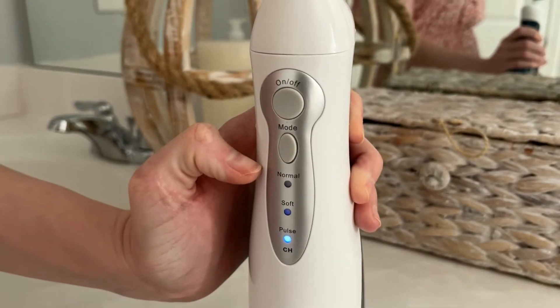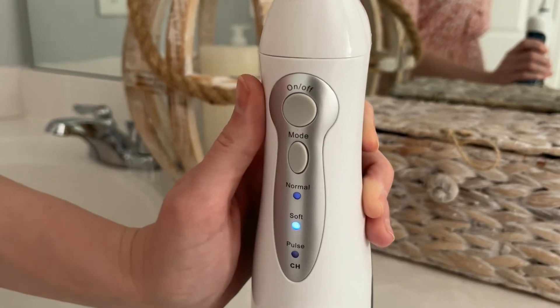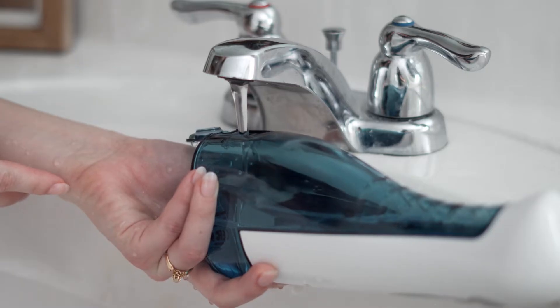The top indoor water flosser comes with three modes. Soft mode is the one you want to use first when starting out, or long term if you have sensitive gums. Once you're used to soft mode, you can move up to normal mode, which is five times stronger than soft mode.